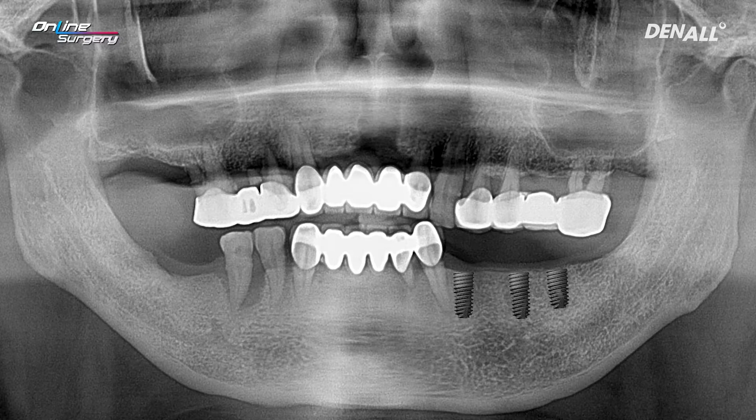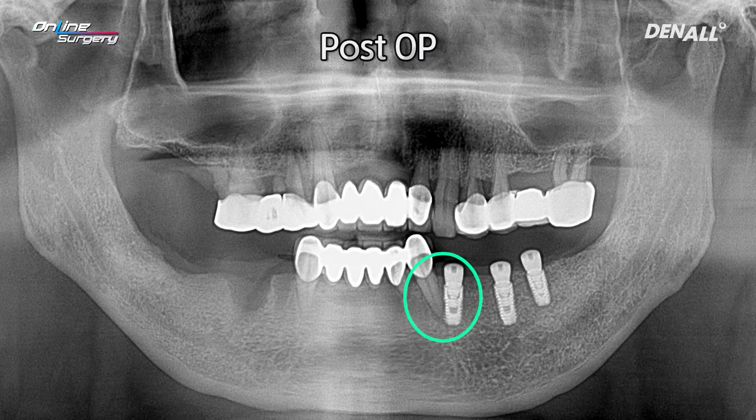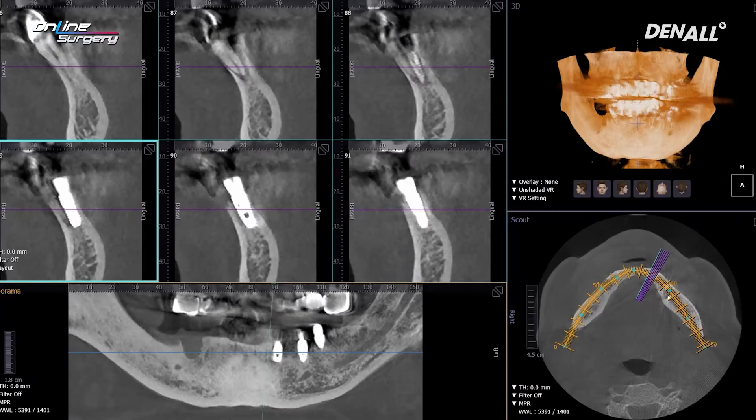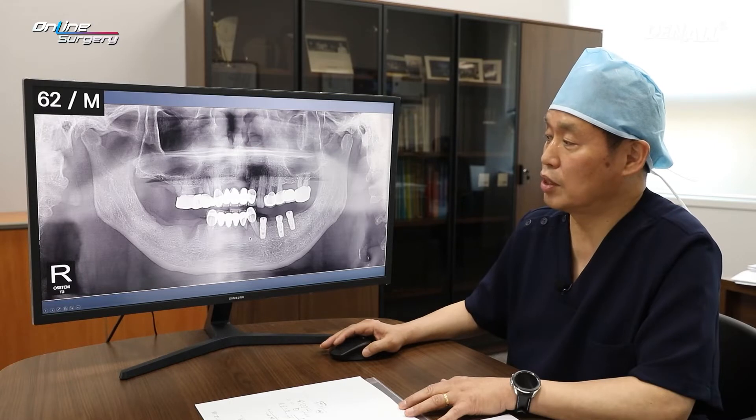This is the post-op x-ray. As you can see, it is slightly close to the canine. Let's look at the CT — it does not touch upon the canine root. The lower anterior extraction is going to be done and an implant is going to be placed, so at present it's not going to be a huge problem. Post-op, the patient did not complain of any symptoms.